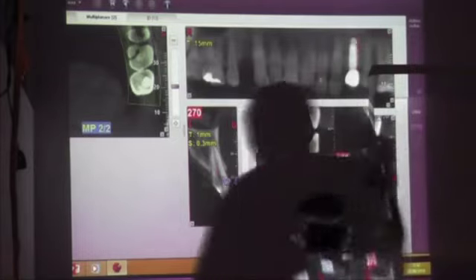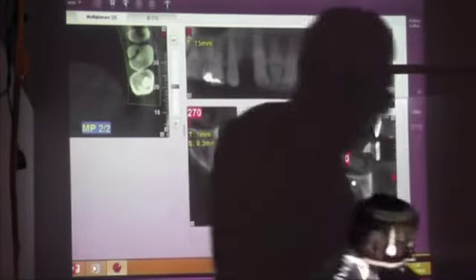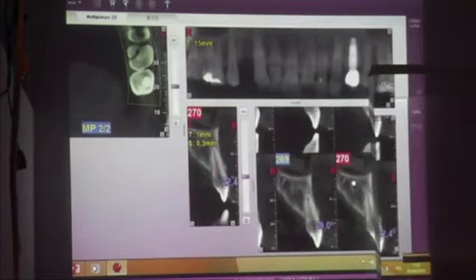I want to ask you, how you see this implant? Is it good? Control that. Is the doctor very important? Show me the case. I have this case, I want to put the implant. Okay, and send me the patient. I make the X-ray and I show this implant. Control. Is this position good? It's good. Perfect. Very nice in the center. Perfect in the bone.